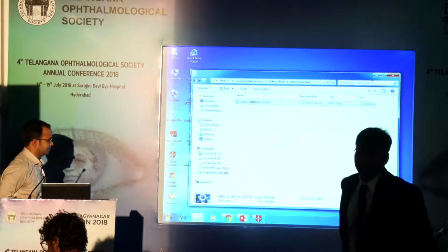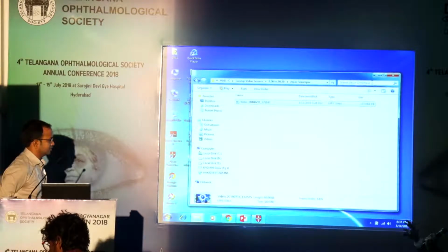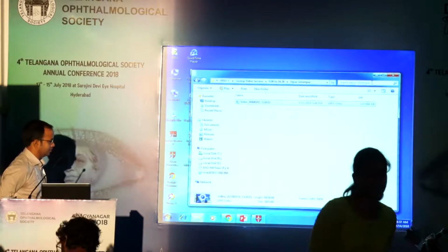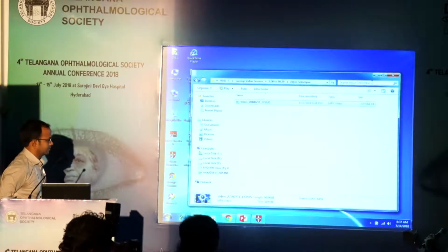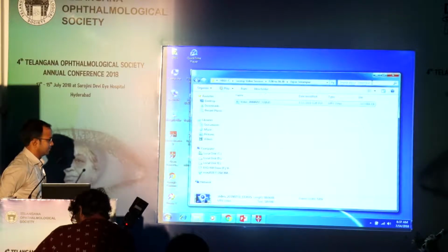And third thing is, it cannot cause lesser astigmatism because your graft host junction becomes very bulky, and it is not cut by a femtosecond laser, you're cutting it manually. So the edges cannot be round. In fact, you might end up with more astigmatism. And it takes much longer to do, the surgical time is more than normal. As the surgical time gets prolonged, more endothelial cells get killed also.